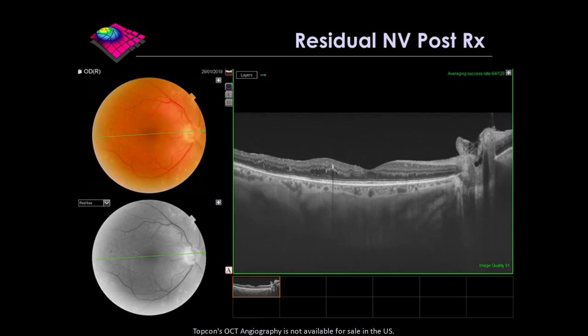Clinically, it looks much, much better, like a lot of it has regressed. But what's interesting is that there's still a lot of this tissue here. And if you look carefully, clinically, you can see that there's something still there on the disc. And so that would tie into this clinical problem that I said: do you just keep lasering this person over and over again? Or at what point do you just say, this is inactive? And how do you judge that?